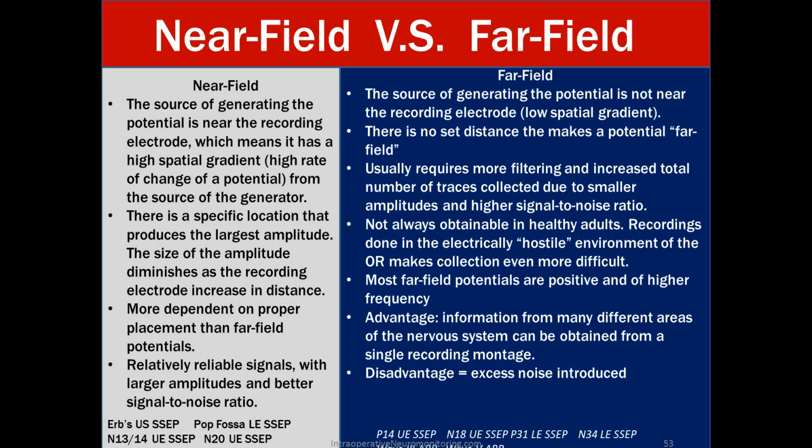Your N13 or 14 upper extremity SSEP, the P40 or P39 or P37, that's all the same response. It's just named differently because they have different latencies in different textbooks in their normative data, so don't be fooled by that. Here I called it P39, but you'll see elsewhere I call it P40. Those are also near field responses. So is the N20 for the upper extremity. Those are all cortical SSEP responses. And then wave 1 of your ABRs is that near field response.